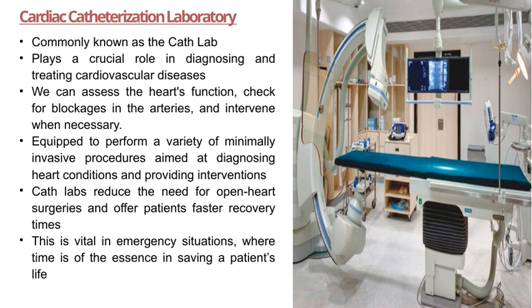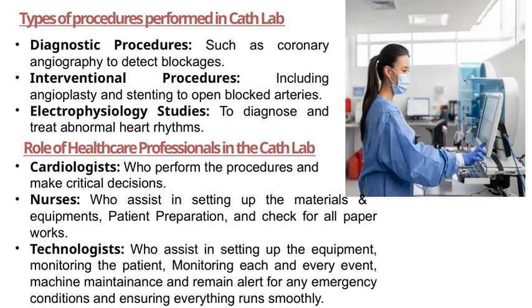These procedures help us avoid more invasive surgeries like open heart surgery, making treatment safer and more efficient. This is especially critical in emergency situations, where every second counts in saving a patient's life. Overall, the Cath Lab is a cornerstone of modern cardiovascular care, combining precise diagnostics with timely interventions to improve patient outcomes. Now, let's take a closer look at the different types of procedures performed in the Cath Lab.